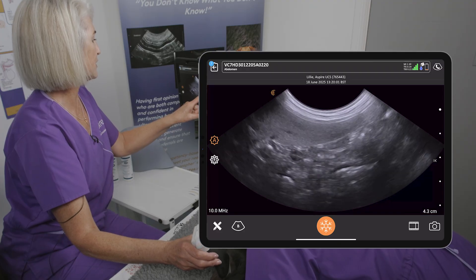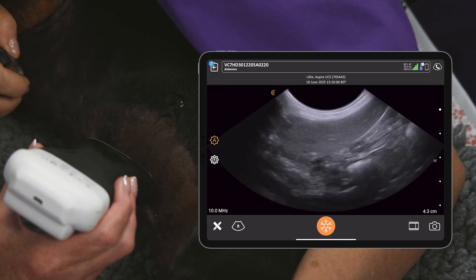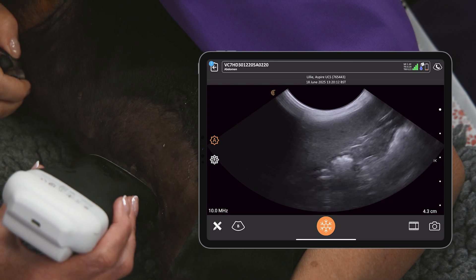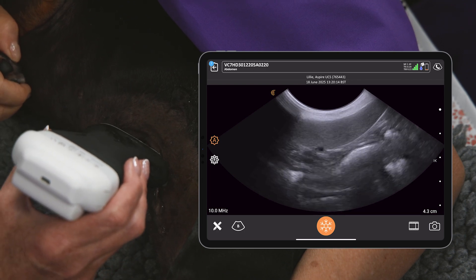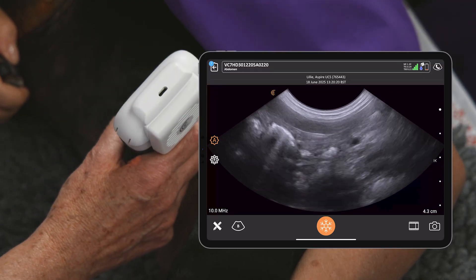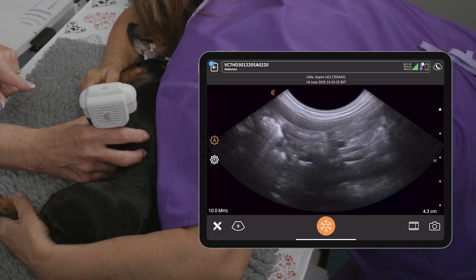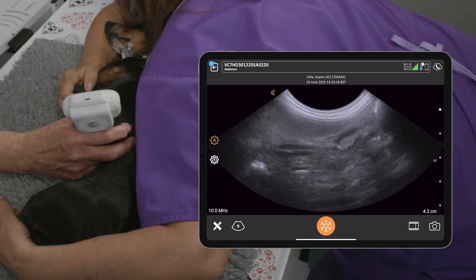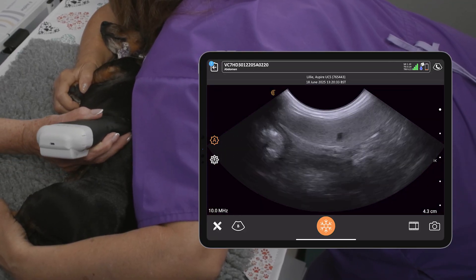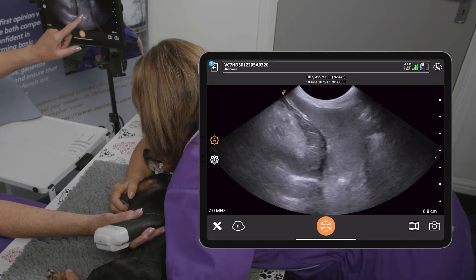Going back to 2D, we want to look at the cranial margins as we examine the tail. Come all the way through the spleen until you've seen it in its entirety, scanning until you run out — just as with every other structure, run out beyond the borders of that tissue. Then I'm going to turn to short axis on the spleen, which means turning the probe orientation so it faces towards me, and we scan right up underneath the rib cage.